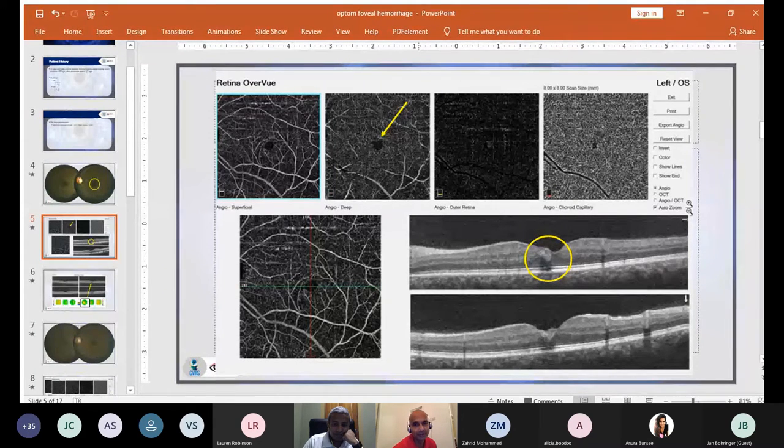But I think you're right. You have to think of the most common causes of retinal hemorrhage, although it doesn't fit with the usual suspects, things like diabetic retinopathy. So I would say do the bloods like you did, looking for things like anemia and other causes of retinal hemorrhaging. It doesn't look like a vein occlusion at all because it's smack in the macula. It doesn't look like the things we usually see with retinal hemorrhaging, like a CNVM. So I think you really have an odd looking intraretinal hemorrhage. And I would say the diagnosis is probably exactly what you said because of the way the history went. And the fact that it resolved means I don't think you need to do much more to follow up on that hemorrhage, unless it recurs.